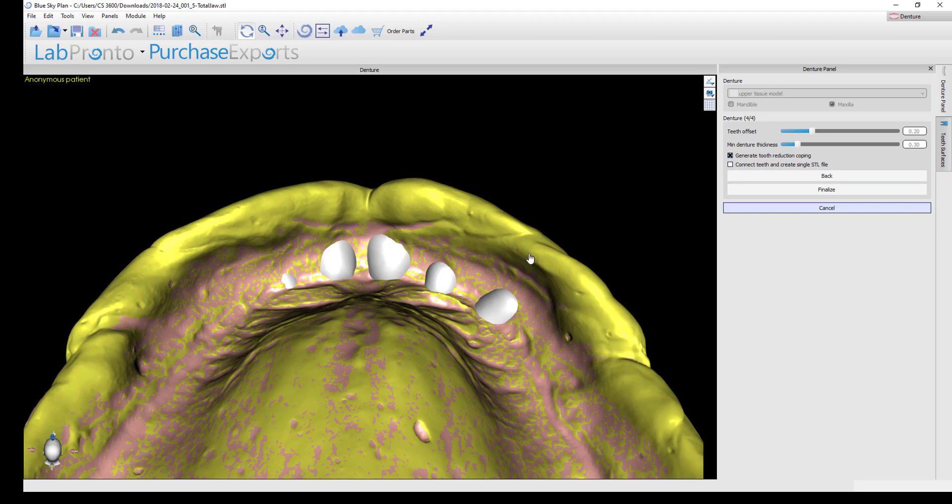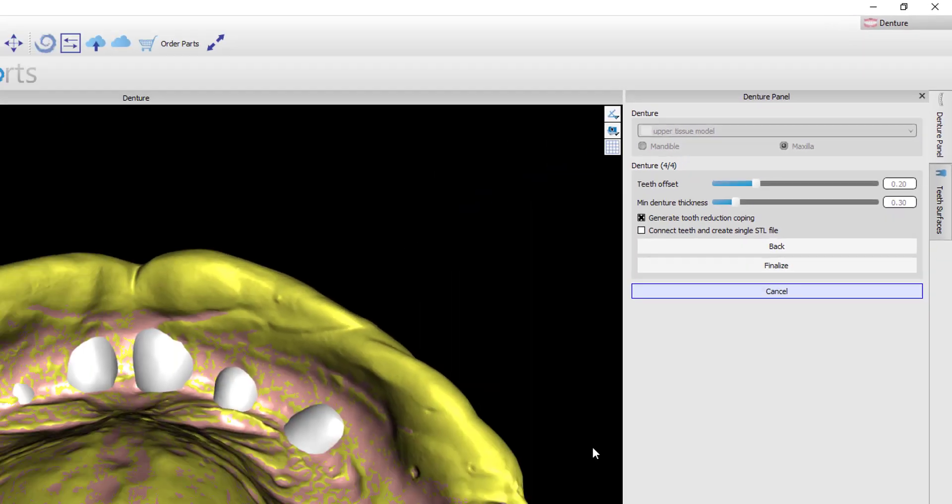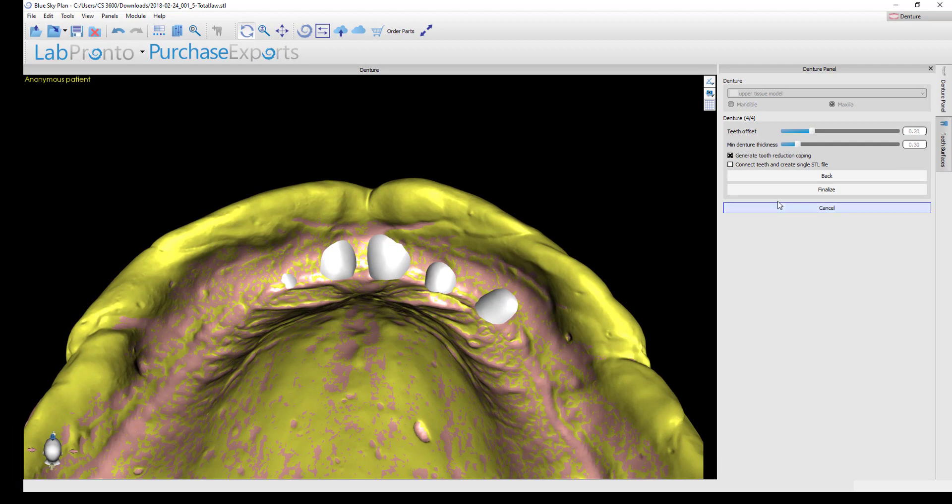I'm not using physical denture teeth here, but I'll turn this on just to show you what the file looks like. You also have the option to connect all the denture teeth into a single STL file, which makes exporting easier and allows you to print or mill the entire tooth chain as a single unit rather than individual teeth. I would suggest always checking that on if you're doing a printed or milled denture using digital denture teeth.